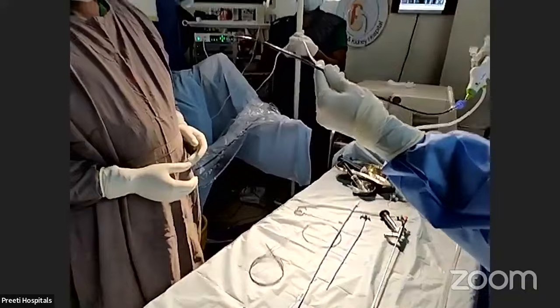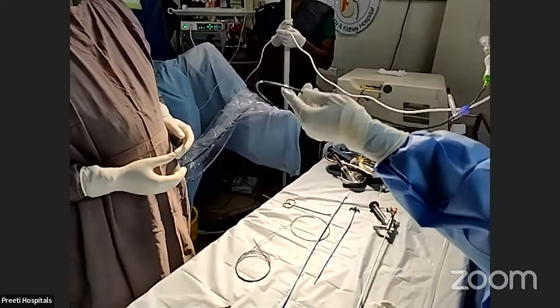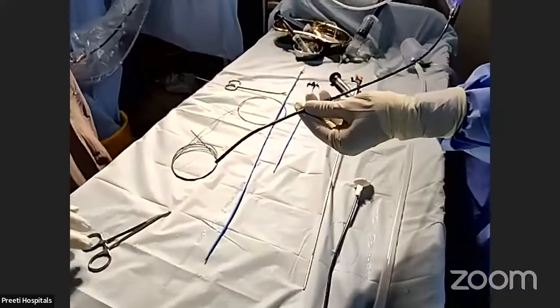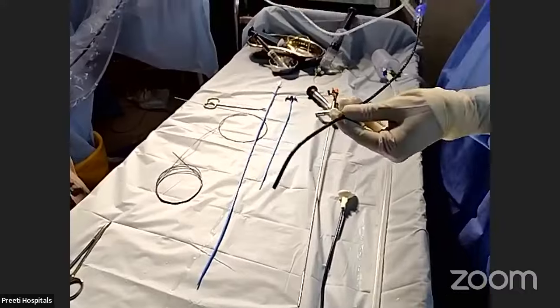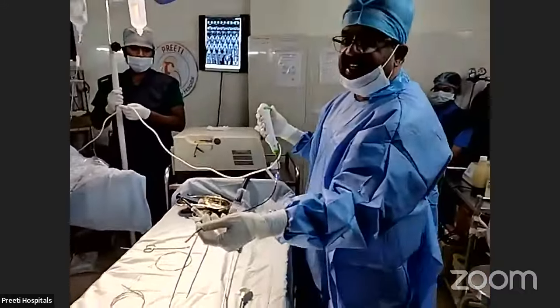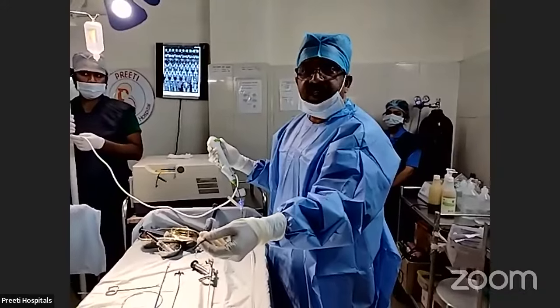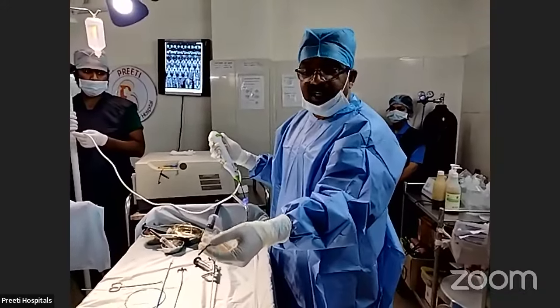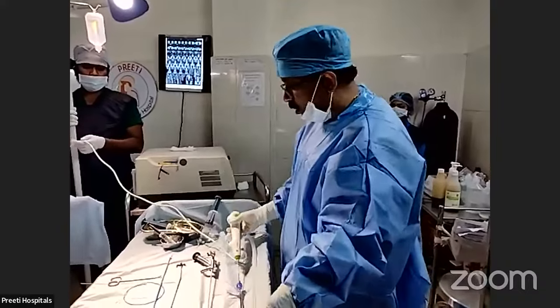If you want to bend with this, see, you can bend like this. See, this much is the bend. You are able to observe with my flexible scope, I am able to bend this much. That is the beauty. So when this sheath is inside the pelvis, you will not damage this because you will not move this. So that fear should not be there. Under C-arm, whether it is going freely or not, we have to see. That we will see now.